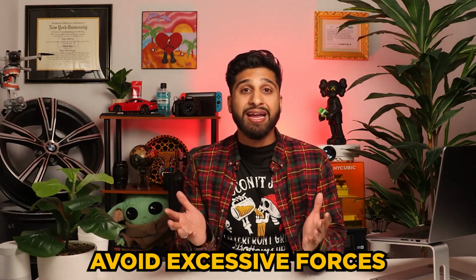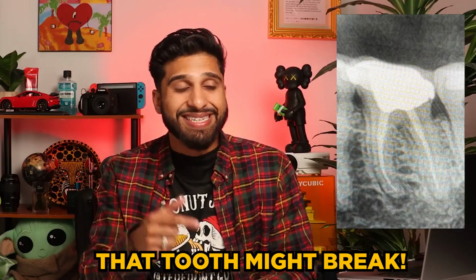Although the tooth exhibited slight mobility, I exercised caution and avoided applying excessive forces, thinking, wait a minute, it's a root canal treated tooth. This tooth might actually break on me. And guys, you can always get a great feeling of how locked in that tooth is in the bone just by gently applying some forceps on it and feeling it out. You gotta listen to those teeth when they're talking to you. But if this is hard for you right now, don't worry. This intuition comes with practice, so never force anything.